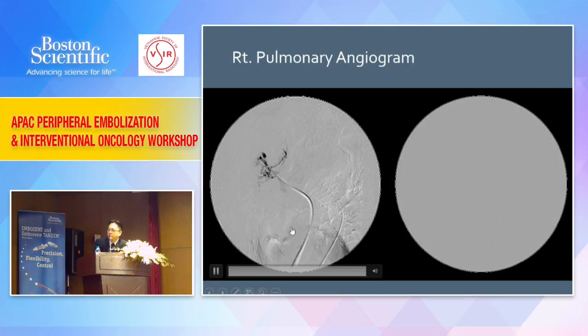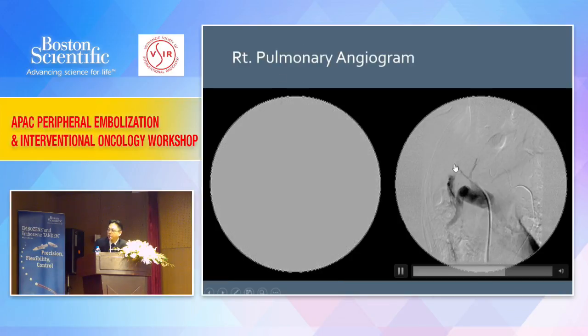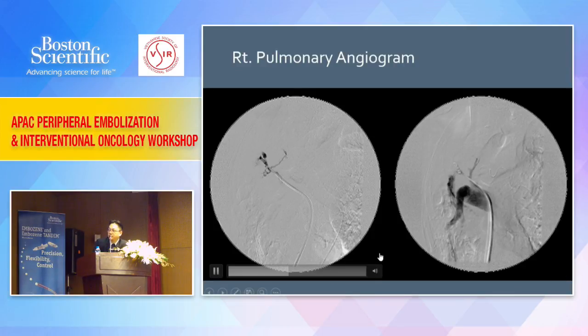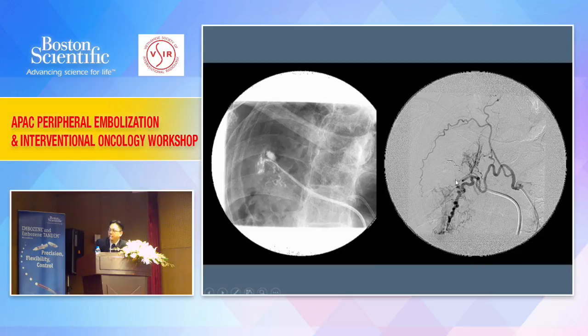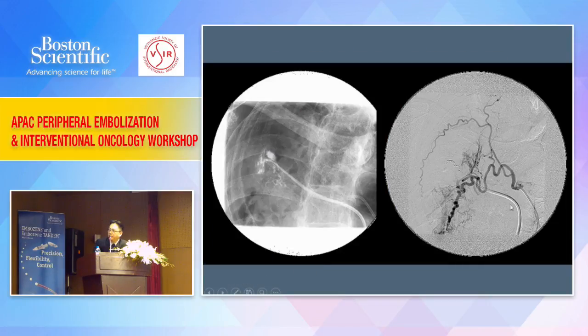But instead, if you go through a pulmonary artery and selectively embolize, block it off completely, then you achieve your endpoint. This is another type of aneurysm. You really need to target it appropriately. In this situation, maybe the use of a detachable coil may not be that critical.